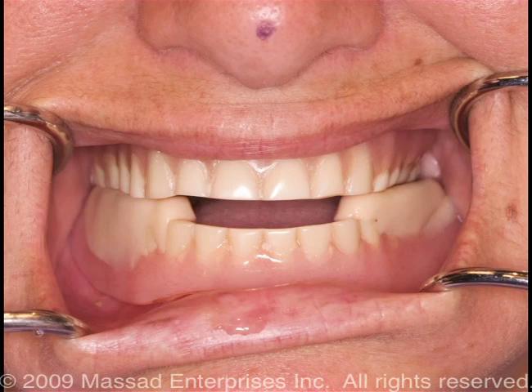This is the complete splint which the patient will now wear to allow the muscles to rebound to their proper length and allow the patient to accommodate to the improved vertical dimension while the new prosthesis is being fabricated.